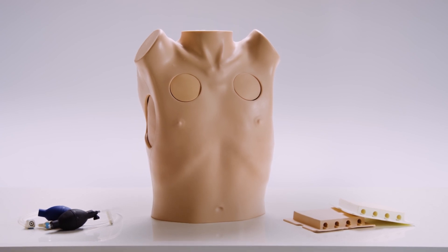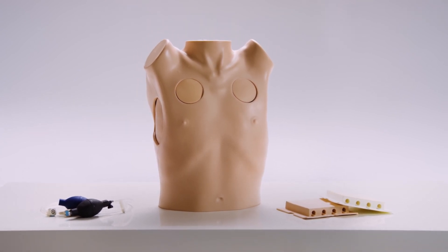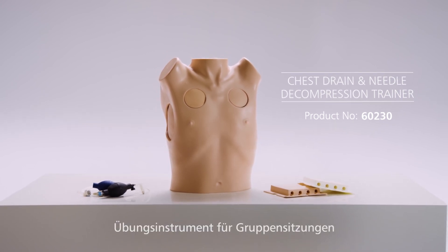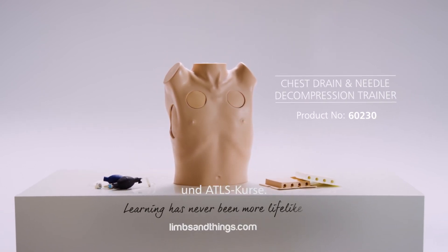The chest drain and needle decompression trainer from Limbs and Things is a versatile and cost-effective training tool, ideal for group training sessions and ATLS courses.